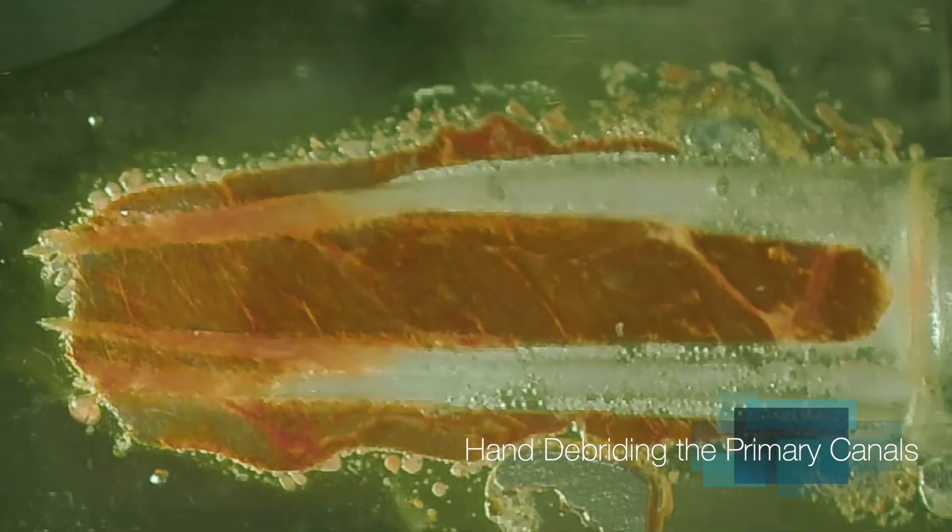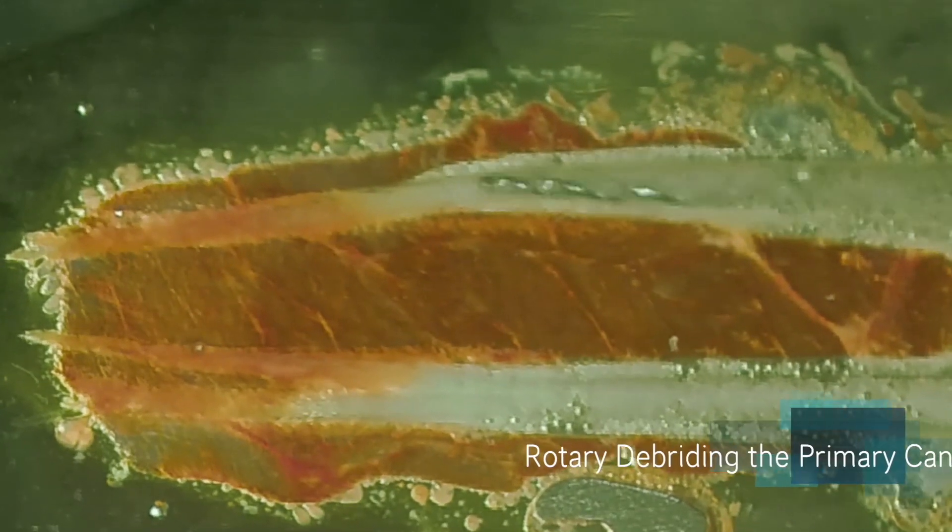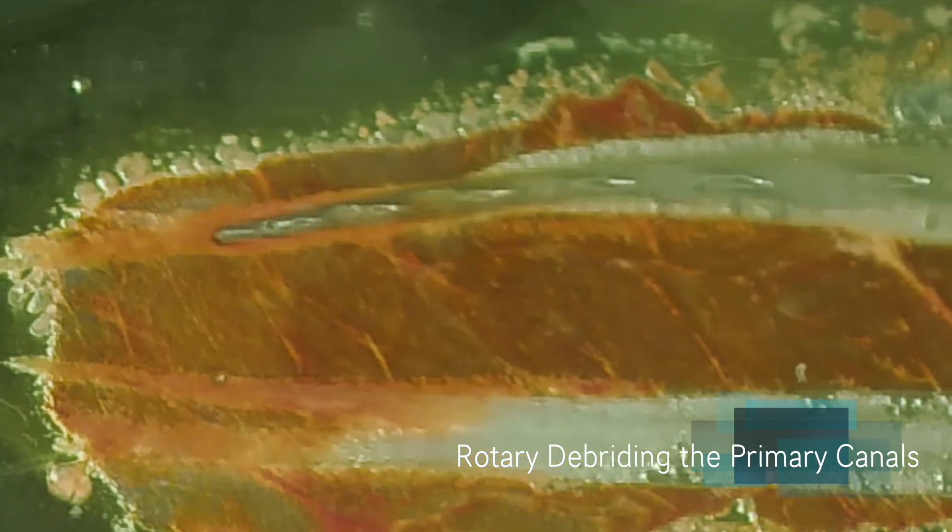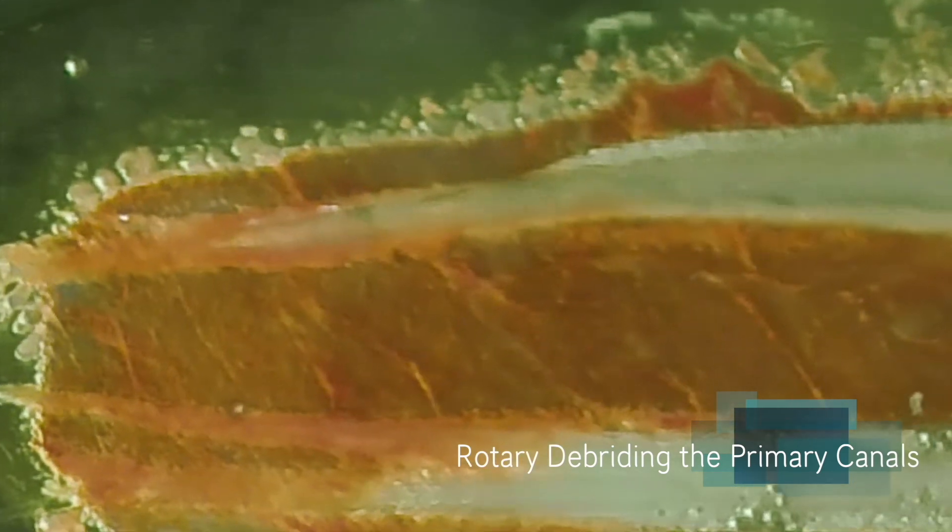Watch what happens when we spin this thing at 300 RPM. It is actively auguring material out of the canal, pulp tissue out of the canal.